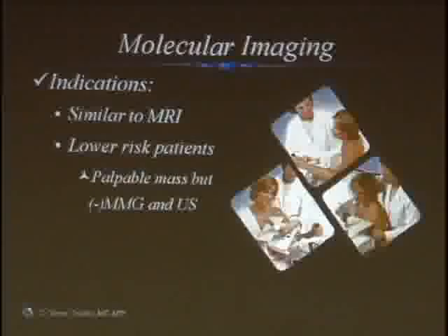Well, the patient's really worried, and you got to do something. Patient is low risk. Insurance will not pay for an MRI. You're in a jam. What do you provide this patient to give them the sense of security that they don't have an occult breast cancer in there? You give them a BSGI because insurance will pay for it. For low-risk patients, it's a problem-solving tool, and it has the same negative predictive value as an MRI. So if it comes back negative, wow, that's like having an MRI at a discount for a low-risk patient.